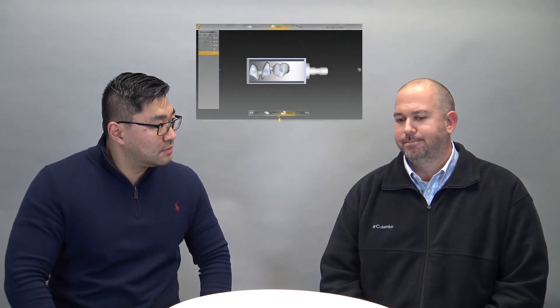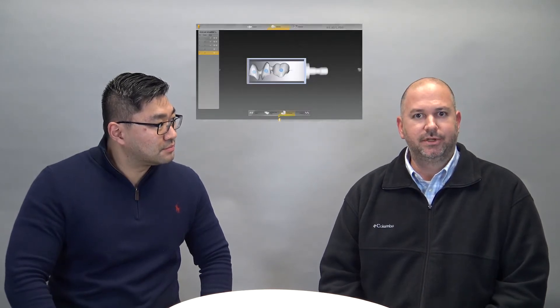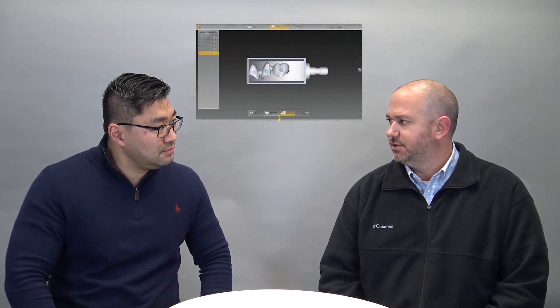The in-lab software itself is very user-friendly. What I like is I can have multiple design stations for no extra fee. So we have a few design stations in our lab. The in-lab software uses biogeneric. Biogeneric means it looks at the teeth next to it—its morphology, shape, position—to get its proposal. The proposals are very good, so you don't spend a lot of time with your tools trying to make it look good.